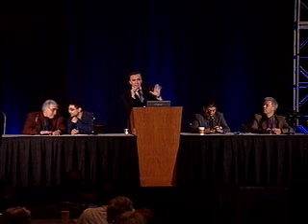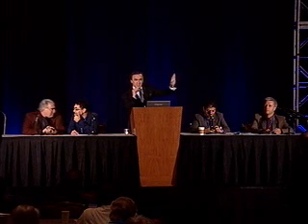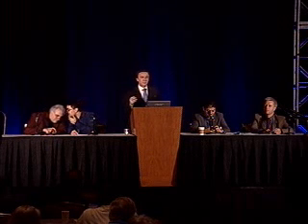But we follow and get the Doppler for at least 60 seconds to get a video clip and to see, during the 60 seconds, which is the time of reflux in the opposite direction. The time definition is okay.